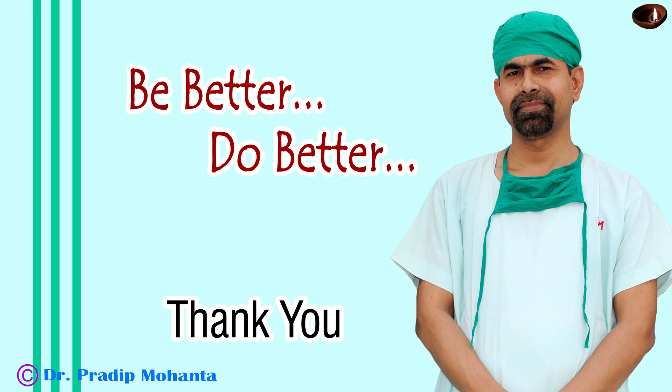Thank you very much for your attention. I hope this video will help you in developing your surgical skills. Be a great surgeon and serve your patients with love, respect, empathy, and great surgical competence. This is a hard cataract and we have completed this surgery in seven and a half minutes.